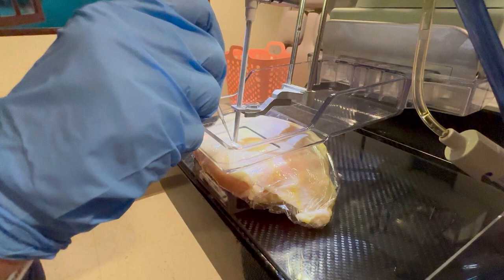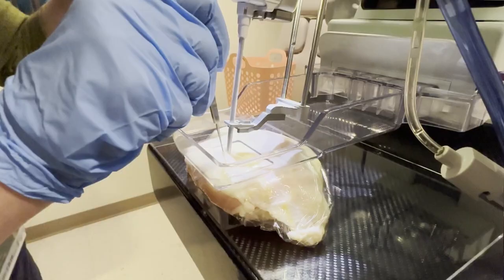And you can see here how I've just hooked that skin hook into the skin of the chicken breast, and I'm just pulling it up towards the shaft of the needle as I twist it. And at this point, you're just going to go on and do your biopsy as usual. You just keep a very close eye on that incision site and a close eye on the needle. Just make sure that it's not sucking any skin down and that you have an adequate vacuum. If you don't, then just tighten that little twist.